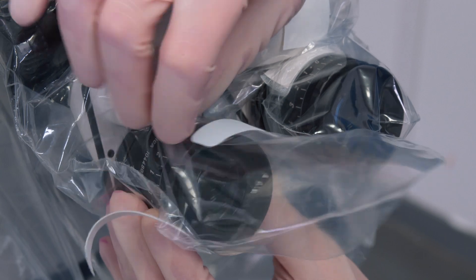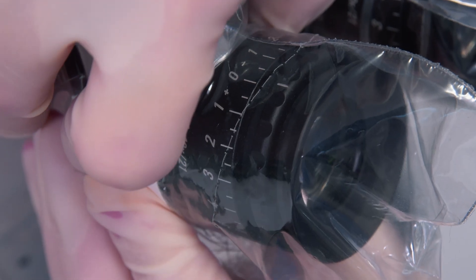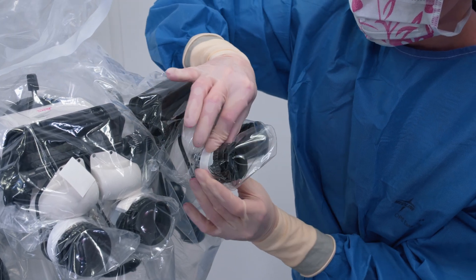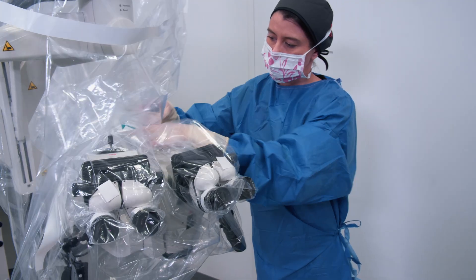Be careful — the eyepiece drapes are perforated at their end. It is important to be gentle in order to avoid any detachment. Secure the drape using the Velcro straps. Put the remaining drape inside the empty space.